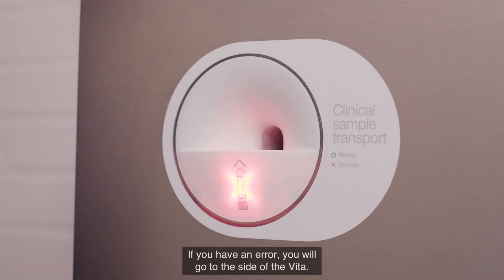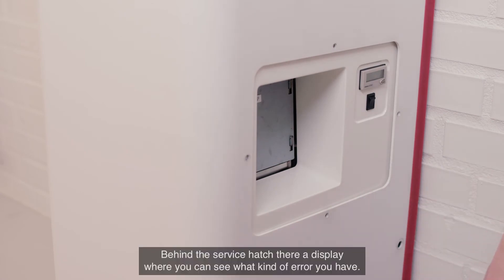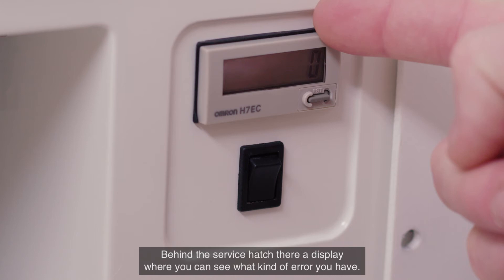If you have an error, go to the side of the Vita. There is a service hatch, and behind it there is a display where you can see what kind of error you have.